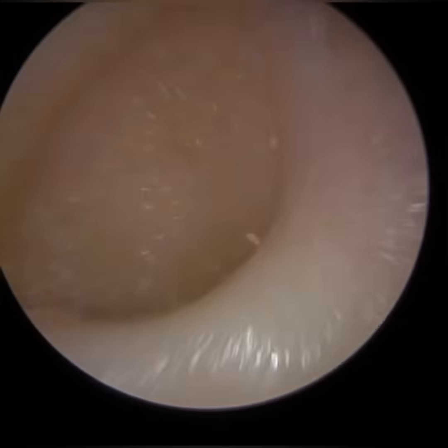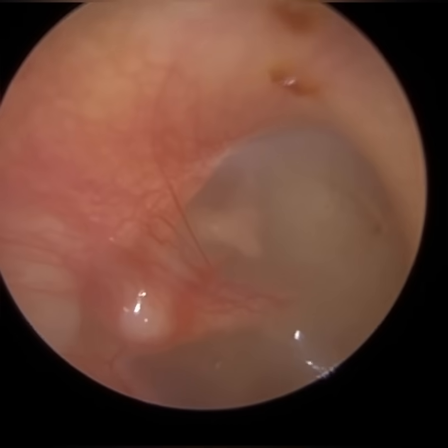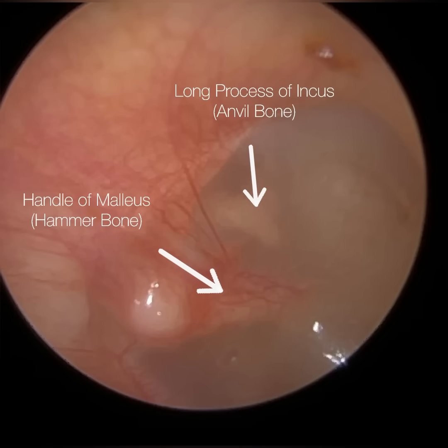This wax has been there for a while — you can tell by the colour, it's quite dark. Now, that's the patient's eardrum, and there's a bit of vascularity of the hammer bone. You can see the blood vessels and capillaries.